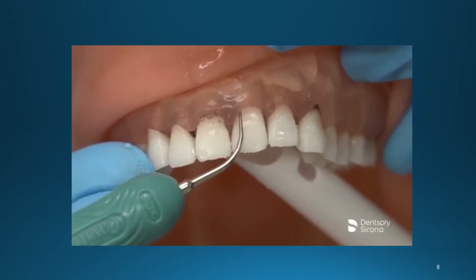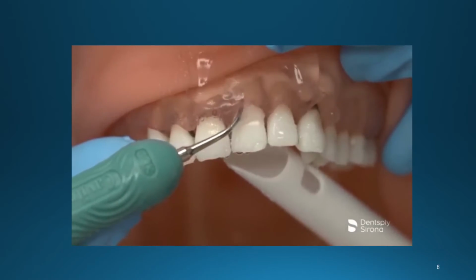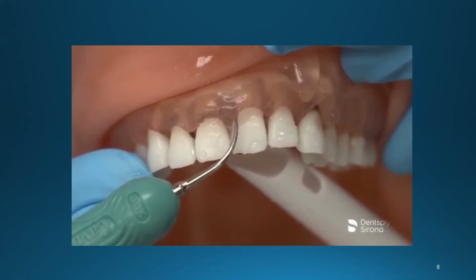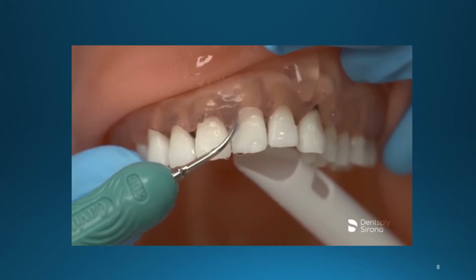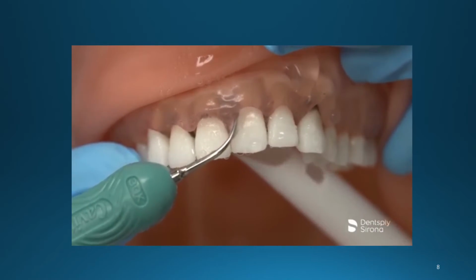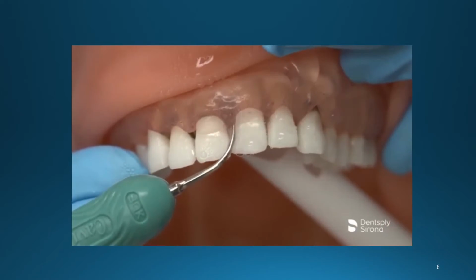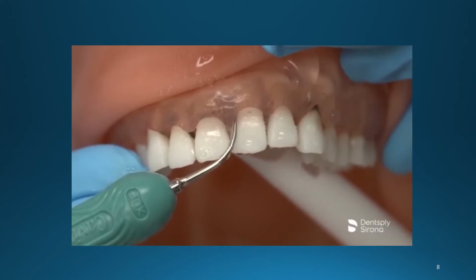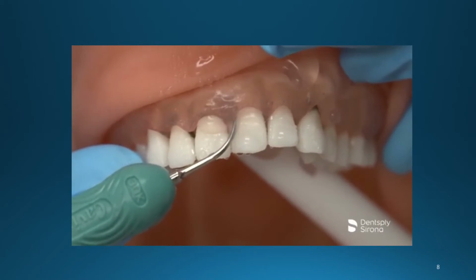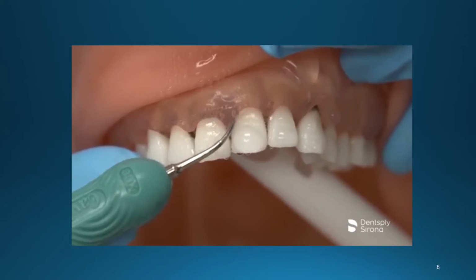As the clinician moves toward the interproximal area, it is important to angulate the insert so that 2 to 3 millimeters of the terminal end is always adapted. Following the vertical orientation, the clinician will adapt in a transverse approach under the contact areas for complete debridement interproximally. Knowledge of each area of anatomy is essential for successful removal of calculus. A thorough periodontal charting and accompanying radiographs are also essential tools for effective ultrasonic instrumentation.